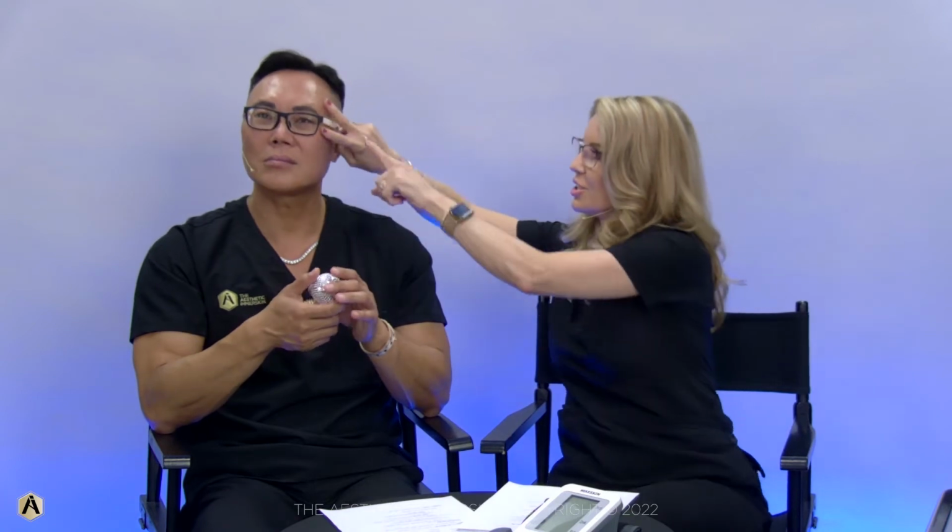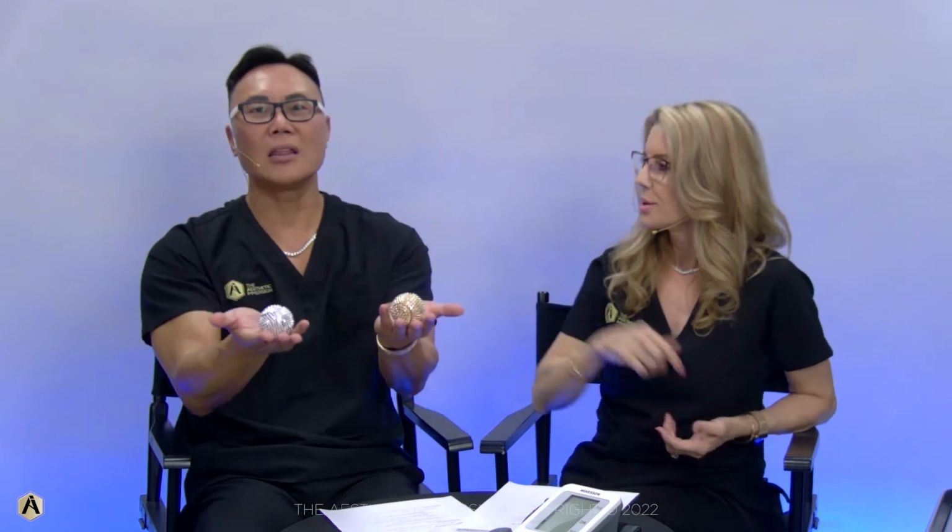I have one that I got at a family practice conference, and it is a small device. I push the button, but it's got a piece of plastic that goes in a U, and it's clear, and it lights up. And when you put it on the patient, the U vibrates. This whole thing vibrates, and you give the injection right into it. It's really cool. I can't remember the name of it. It's in my drawer, but anyway, those are cool. But anything to distract your patients.